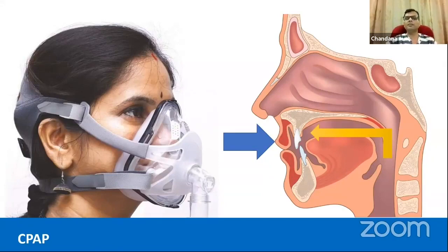So this helps to sort out the oxygenation issue. In type 1 respiratory failure, where your oxygen levels are low, they started using CPAP to help these oxygen problems, but it basically started with sleep apnea. Most of the devices were used in the domestic environment, which uses very low oxygen, sometimes no oxygen at all. If you look at the NIV devices nowadays coming to Sri Lanka, some of the devices cannot be connected to oxygen, and they still sell them to hospitals because people are desperate. We'll talk about them later. But for the moment, CPAP is a continuous positive airway pressure.